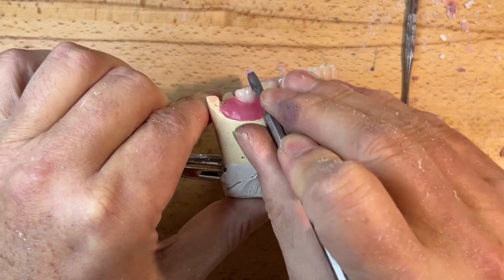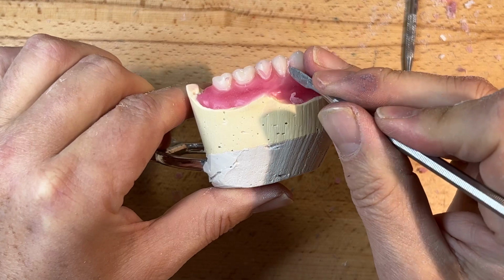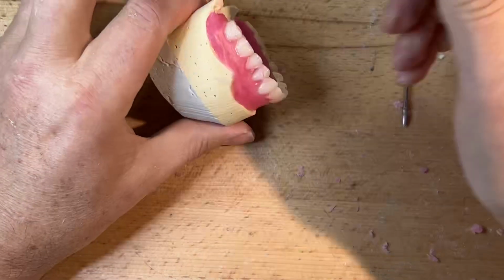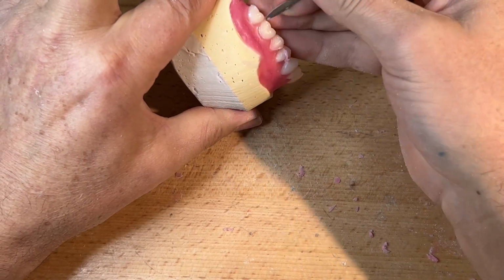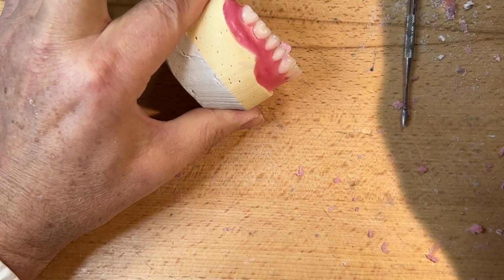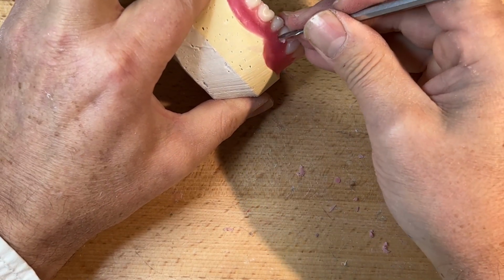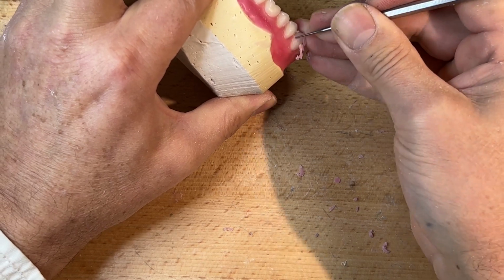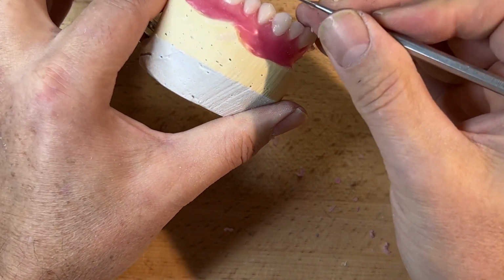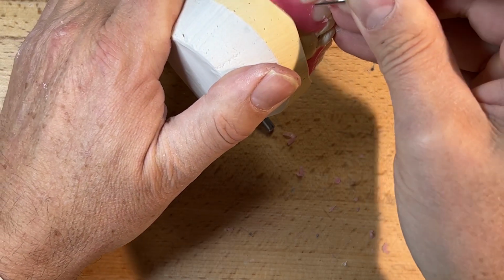Yeah, so we went from a setup video. What an adventure that was. I thought it was pretty straightforward. And then now we're on a wax up. We'll do the whole thing. And again, I'm going to assume it's going to be an hour. Whatever the video, where we're at. Yeah. Upper and lower wax up, hour and a half. Full upper, hour. To trim a lot of teeth in the immediate denture.